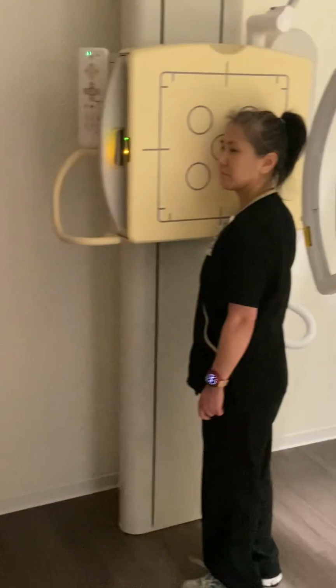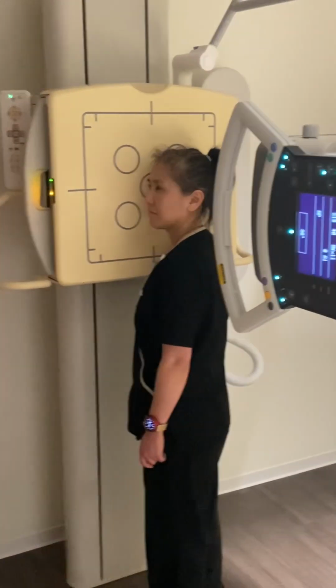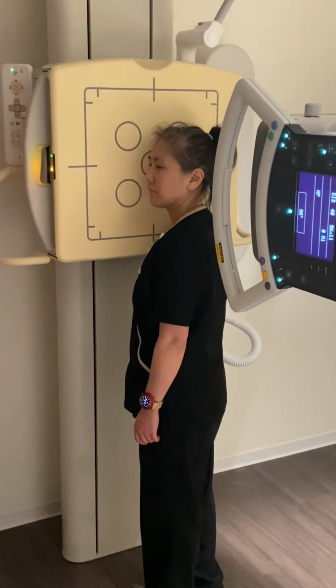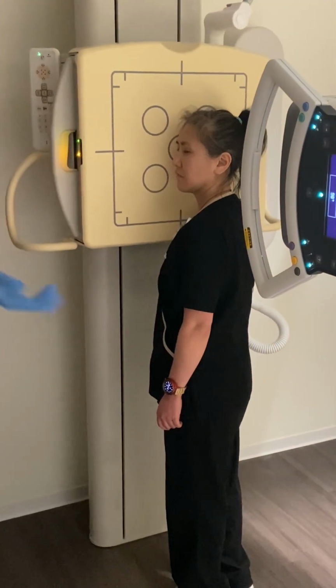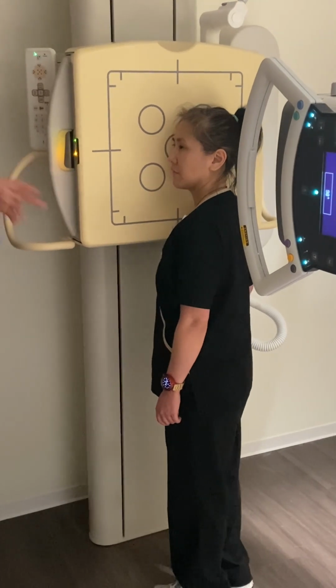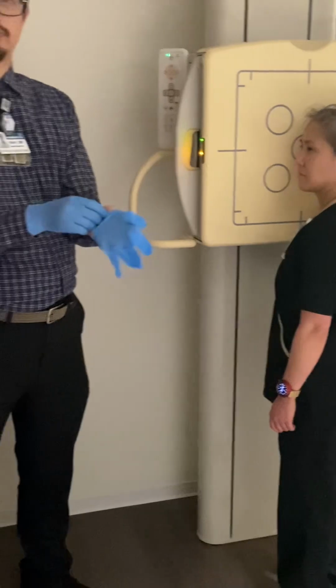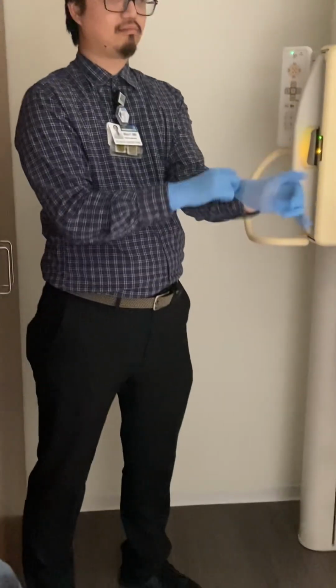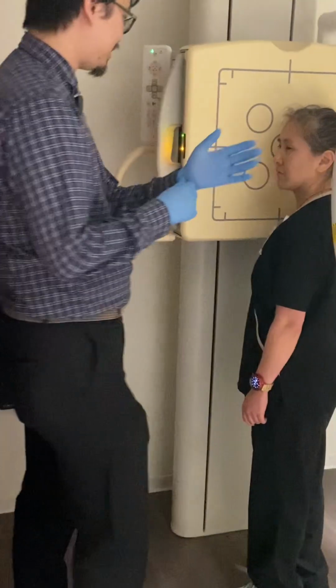I'm going to put on gloves now just to be safe. Because chances are you are going to need to touch the patient's head for this. It is possible to talk them into position, but it is difficult. Actually, you know what? I'm going to try, but chances are I'm going to need to use my hands.